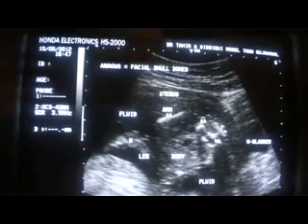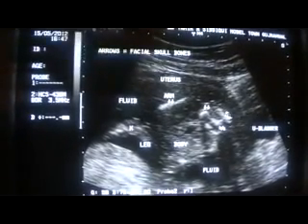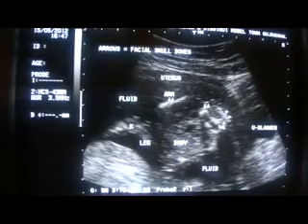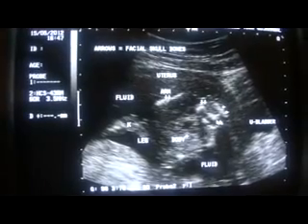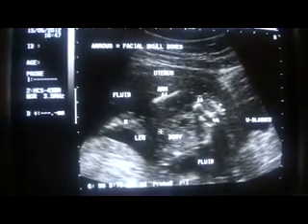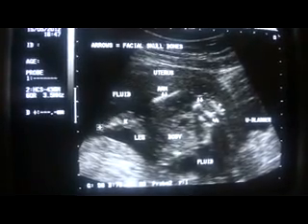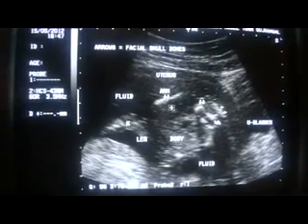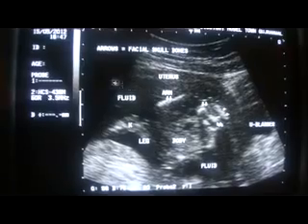Sorry, I said this was a stomach bubble. This is in fact the heart that you can see. Cardiac flicker is clearly visualized in this segment. So this is a case of an ANENCEPALY, and an ANENCEPALY is associated with hyperactive fetal movements and polyhydramnios.